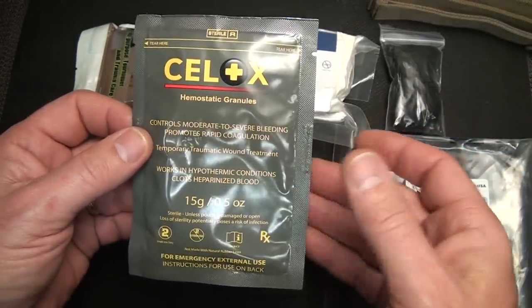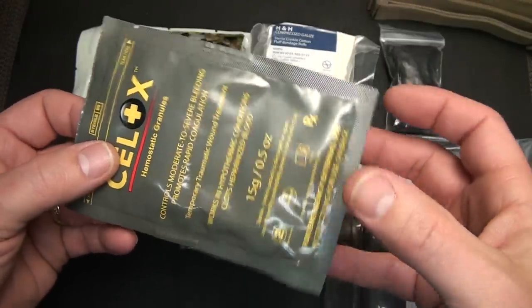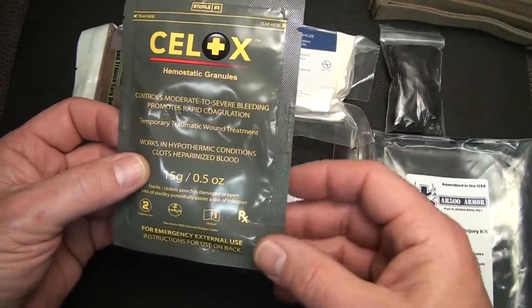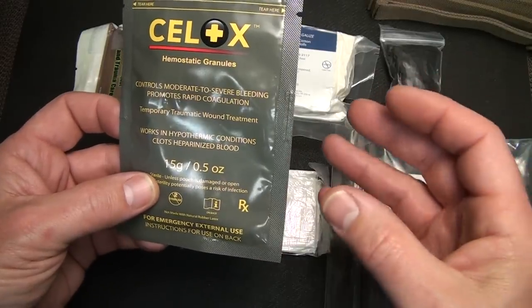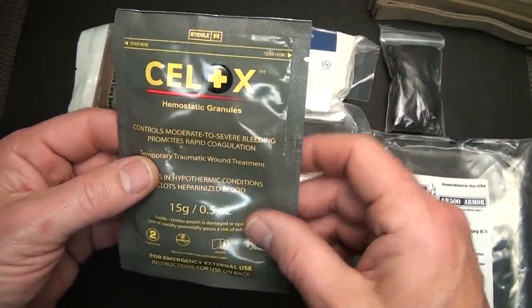And this is going to stop bleeding. You pour this into the wound cavity, and it's going to clot the blood. And so this is really just a temporary fix until you can get to the hospital. But it works very well with clotting the blood and making it slow down and even stop.